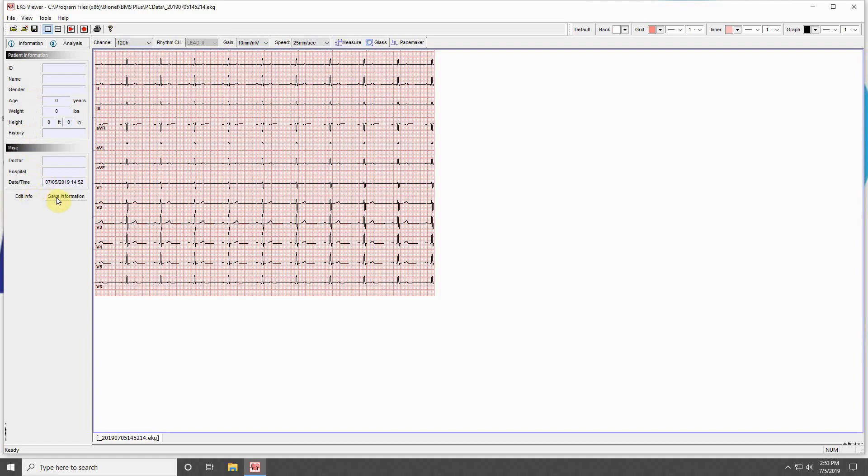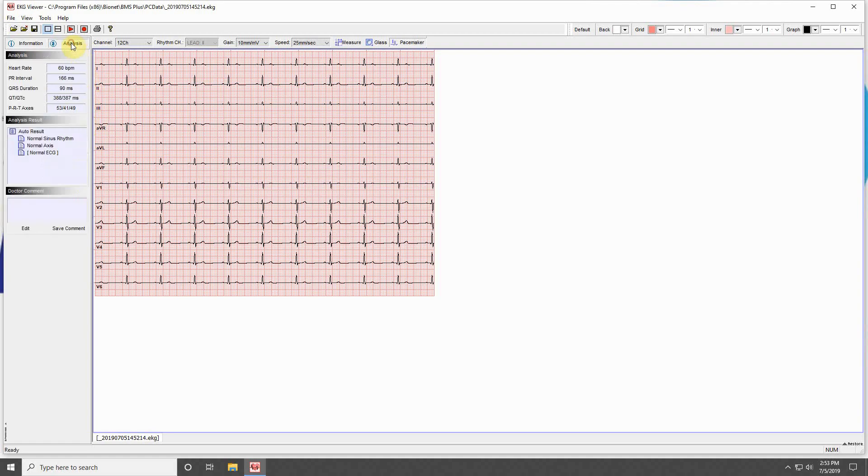There is an additional tab for analysis. You cannot adjust any of the ECG information, but you can add comments to the analysis the same as any information on the previous information tab. Pressing the X at the top will allow you to close the program.